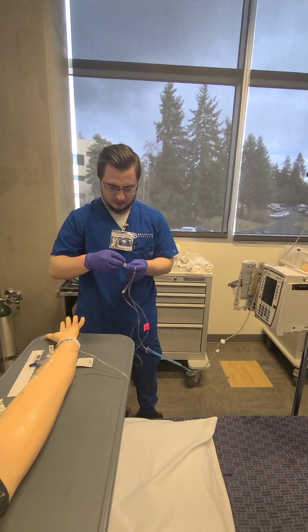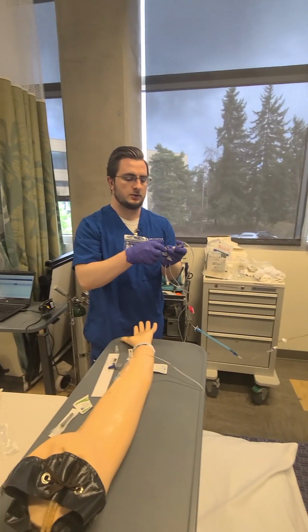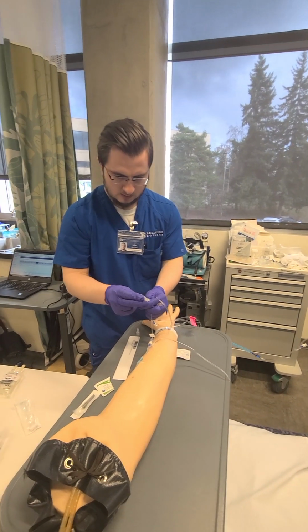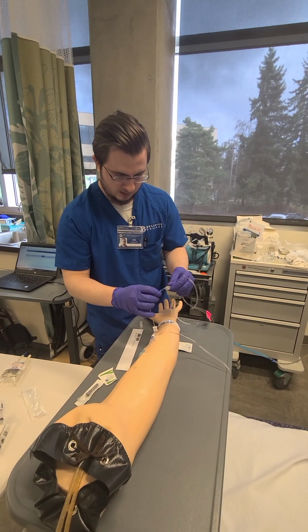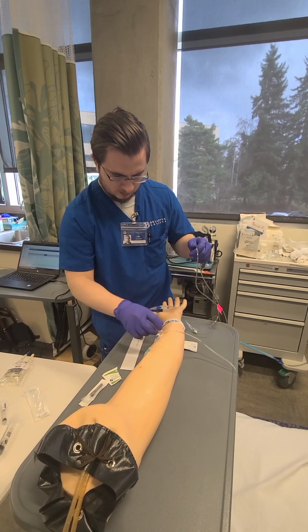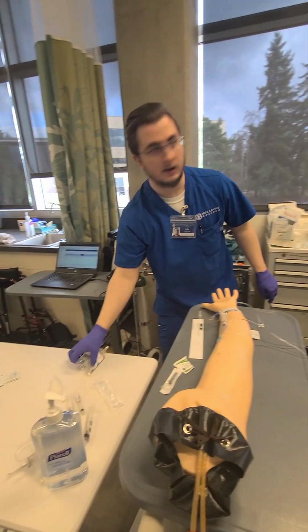Actually, what I'm gonna do is I'm just gonna attach it to my patient's line now. So take this, clean it off again for another 30 seconds because I dropped it earlier. That's good. Attach it. Good to go. And then I'm going to hang my secondary.